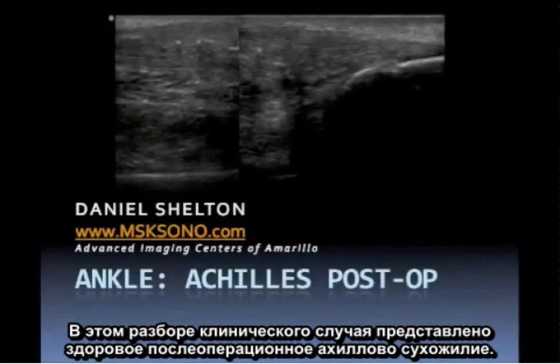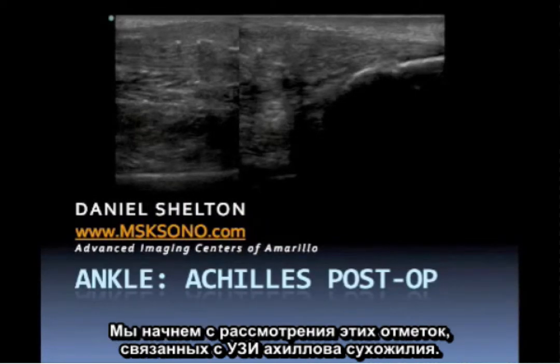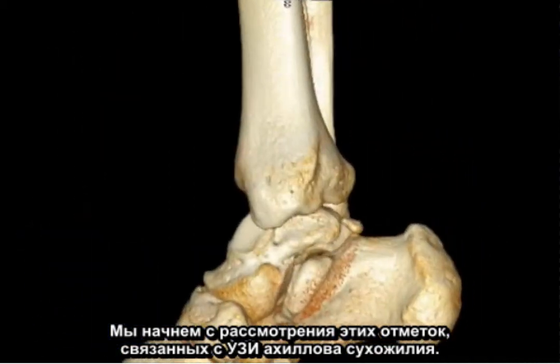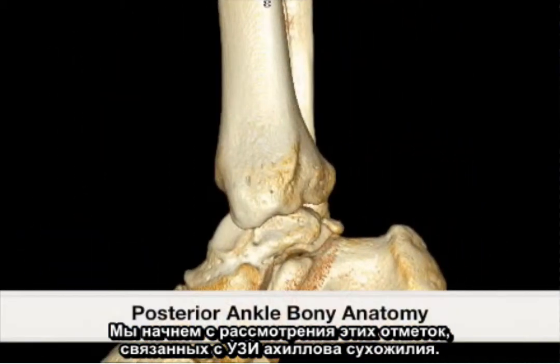This is a case study representing the intact post-operative Achilles tendon. We will begin by reviewing the landmarks associated with ultrasound of the Achilles tendon.